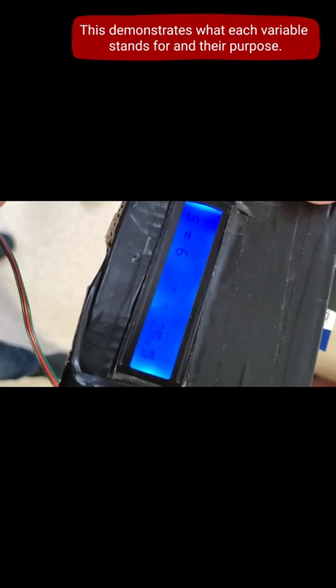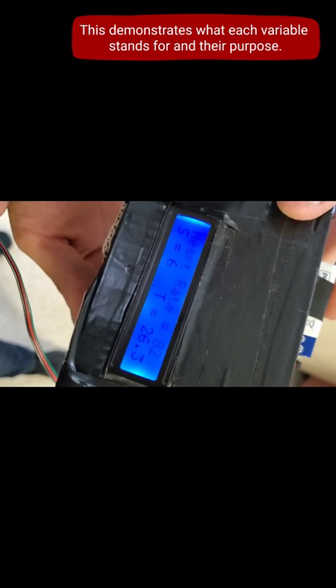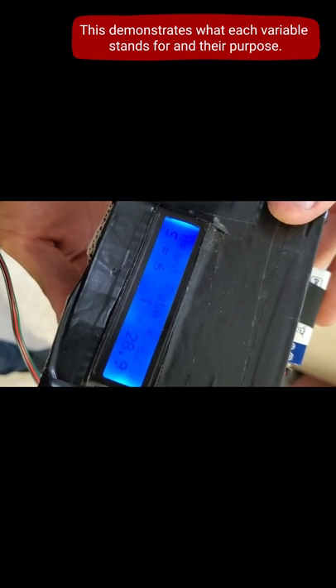T stands for the temperature of the body. Here, we put our finger closer to the center and it should go up.